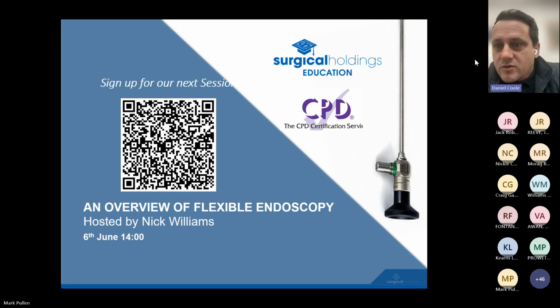There's been a comment around whether it is common for finer telescopes to break more often than others. Jack's added a comment that the 2 to 3 mil scopes are more fragile and the other ones are more robust. 2 to 3 mil are easily bent, causing broken optics.